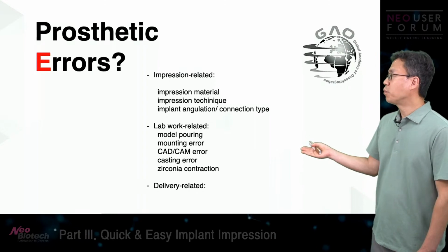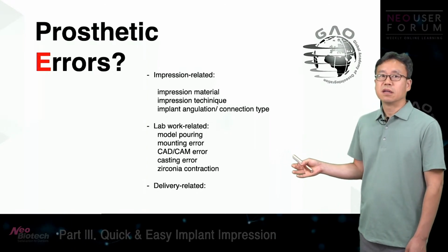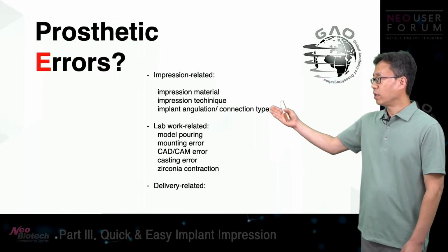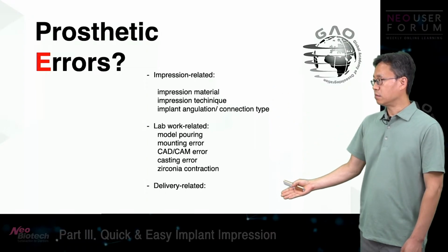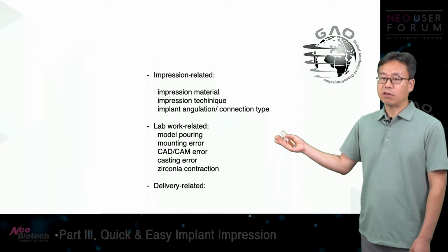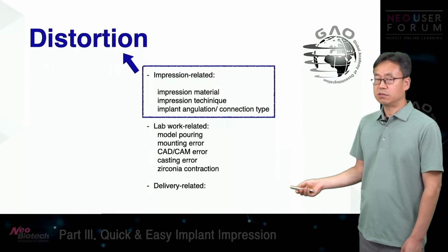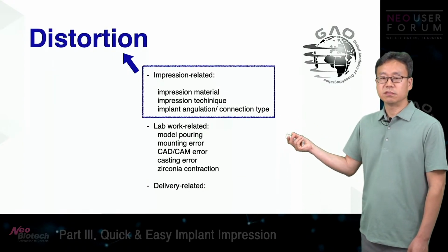There are a lot of prosthetic errors, and they can occur during any of these steps. And much of the errors are from the impression stage, the impression procedure.